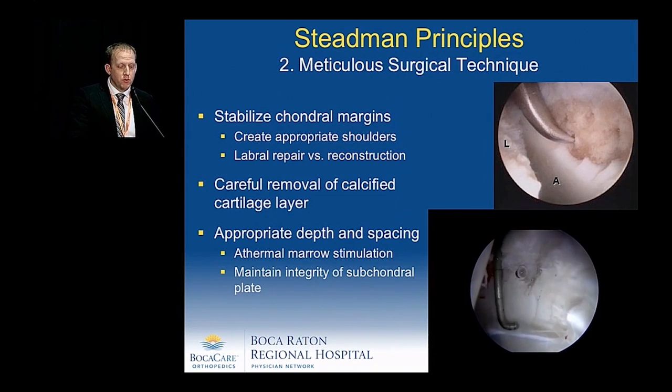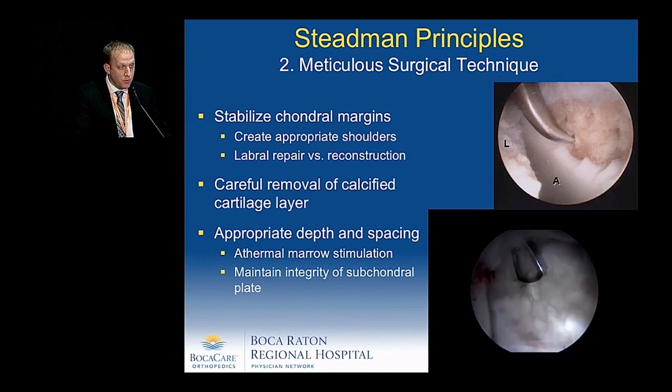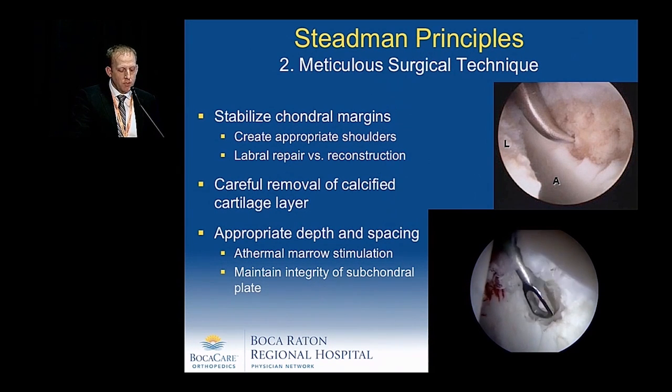Meticulous surgical technique requires stabilizing the chondral margins, creating appropriate shoulders with ring curettes, and performing labral repairs or reconstructions. Carefully removing the calcified layer without going too deep with the ring curettes, then performing the microfracture using athermal marrow stimulation with appropriate depth and spacing while trying to maintain the integrity of the subchondral plate.